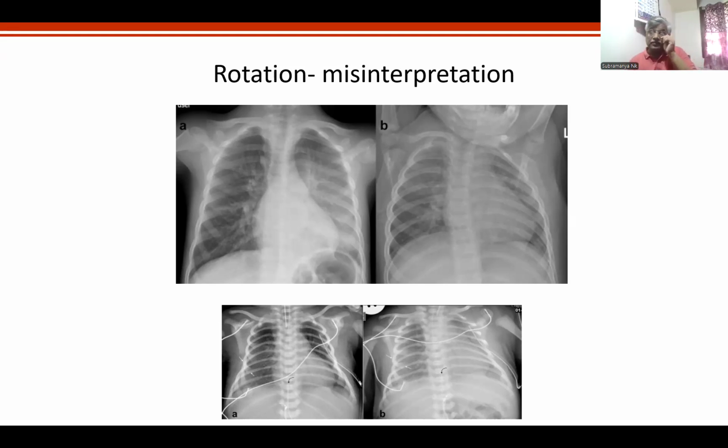Now here, how is CT scan better than an X-ray? It defeats the rotation. CT scan defeats the rotation because multiple X-rays come from all around. It is like shooting from all around. You are the duck, bullets from all 360 degrees. You take the X-ray images, and the computer software computes all these images and makes a perfect image.